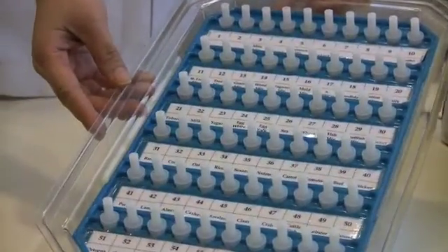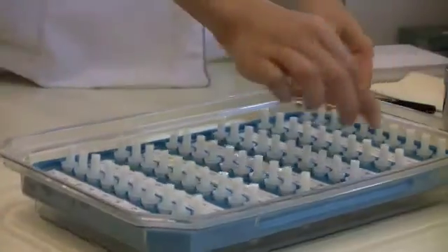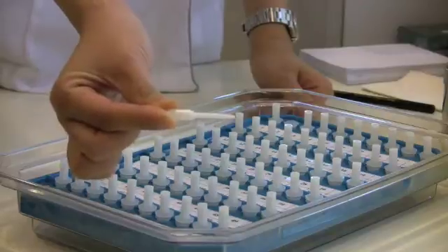The skin test allergen extracts are contained in these wells and the tests are performed using the Greer Pick skin test device.